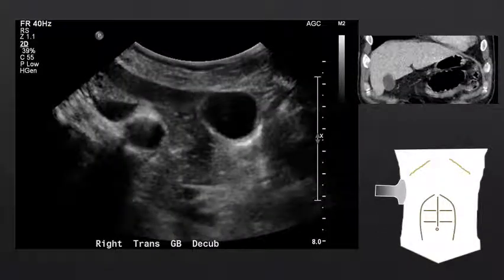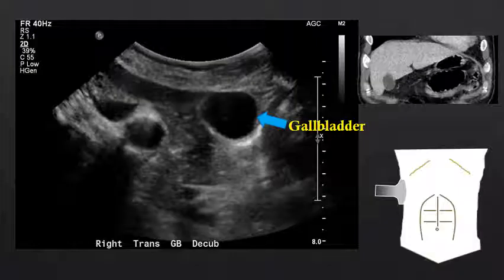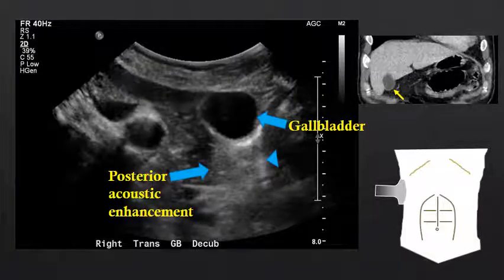If we orient our probe into a coronal orientation with respect to the body, we can see a transverse view of the gallbladder. Again, the gallbladder is a hypoechoic structure with a single-layered echogenic wall. And deep to the gallbladder, we can see what we describe as posterior acoustic enhancement.